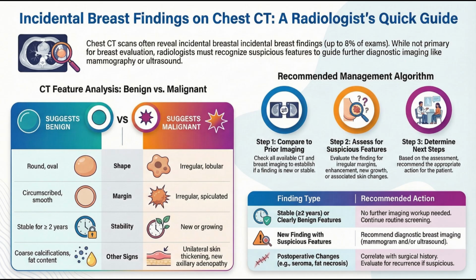And if that wasn't hard enough, there are also these anatomical variants that can look just like tumors. Yes, the benign lookalikes. 2 big ones trip people up on axial scans. What's the first one? The sternalis muscles. They're these little muscle variants that run right along the breastbone. On a single CT slice, they can look just like a suspicious little mass. So you could see a round density and immediately flag it. What's the other one? The axillary muscular arches. These are just bits of muscle stretching from the pectoralis to the arm muscles. And they get mistaken for what?